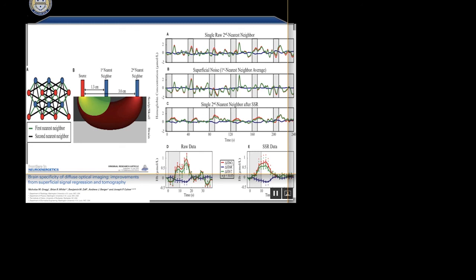So the group at Stanford, Alan Reese's team, they've got a bunch of systems from us, and they've now worked with a bunch of different labs in California. They make their own accelerometers using, I think, an Arduino, might be Raspberry Pi. Those are basically inexpensive. You buy a little printed circuit board that's made for this, and that's what they do.